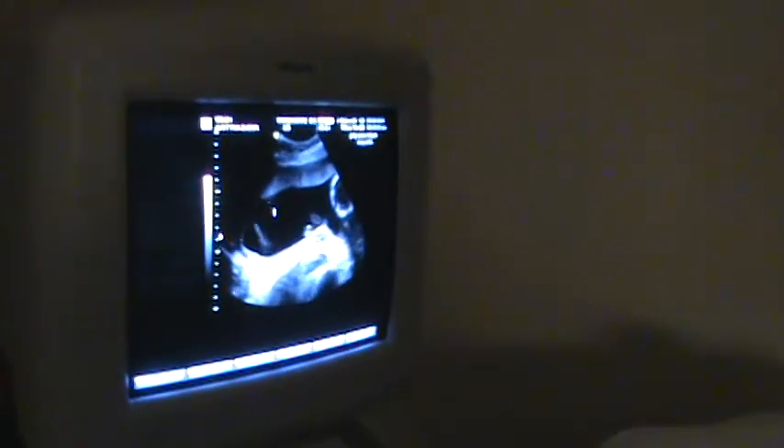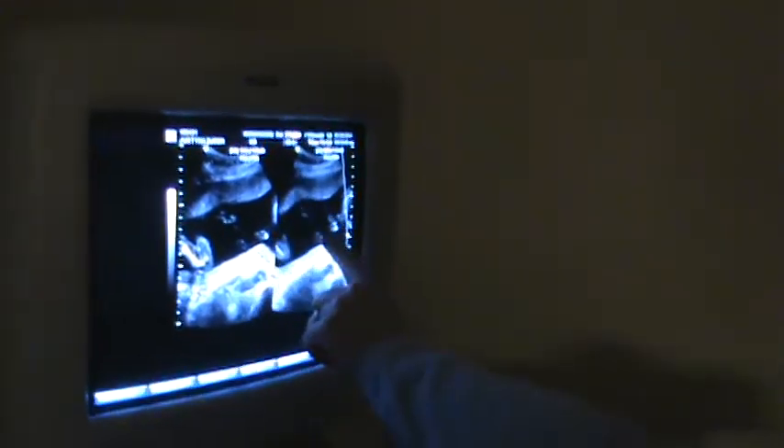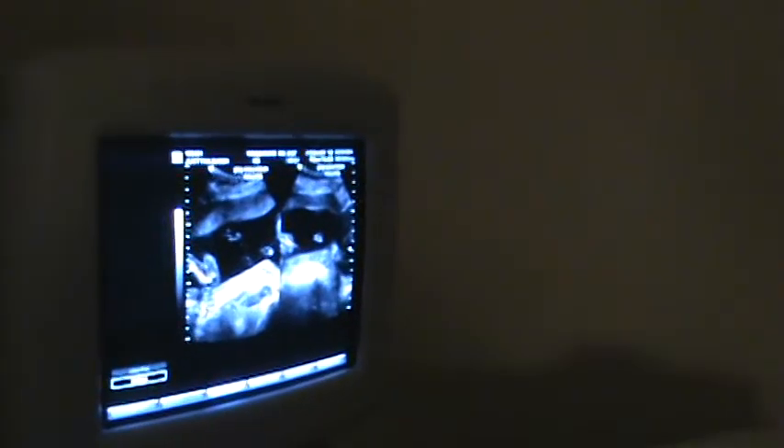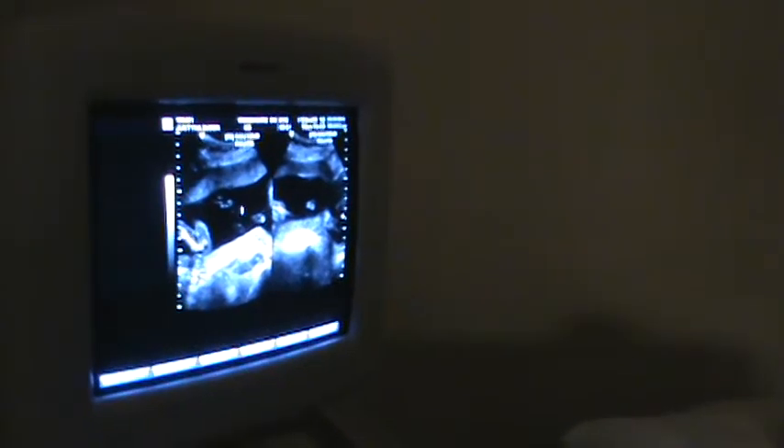This is the placenta across the top wall, and this is right where the umbilical cord comes out. Your placenta looks great — that's a perfect location, it's not near your cervix. And it should look just like snow — no baseballs and no Swiss cheese. Just perfect. All the black is the amniotic fluid that the baby swims around in. And then we're going to get the umbilical cord on a cross section — the cord's just really skinny today. Everything grows with the baby. Do you see there's a little black and a little black and a bigger one? That's artery, artery, vein.